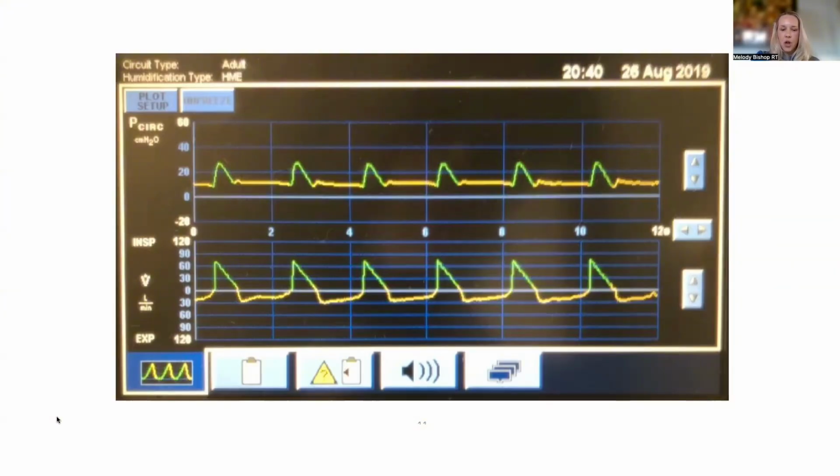So the term asynchrony means full absence. So there is no synchronization. No breaths are matching. The vent is doing its thing and the patient is doing its thing. Dyssynchrony would be anything that is not matched. So technically dyssynchrony can include just slight variations of a breath that isn't fully in sync, versus a complete discord that is completely mismatched between the vent and the patient. Got it. So even though we use it kind of interchangeably, it's technically not interchangeable. And I don't know how much that matters at the bedside per se, but it is important to think about.